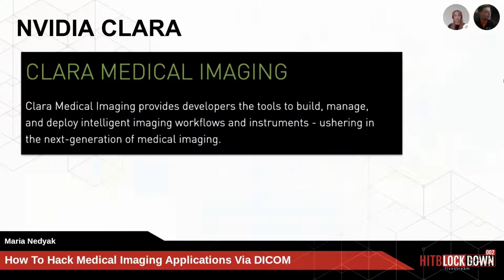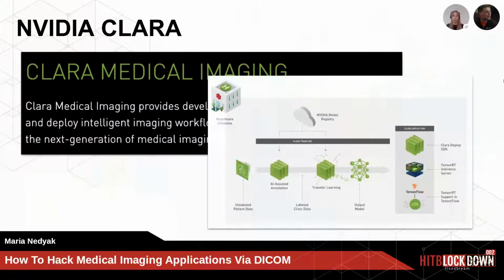NVIDIA Clara. NVIDIA Clara is the most popular machine learning pipeline that deals with medical imaging. Clara Medical Imaging provides developers a set of tools to create medical imaging workflows, and it takes DICOM files as input data.